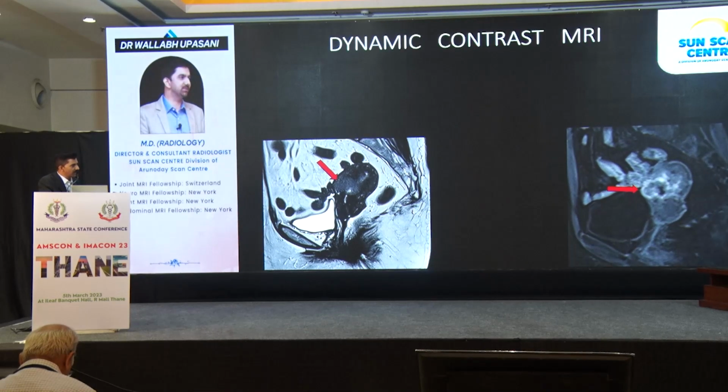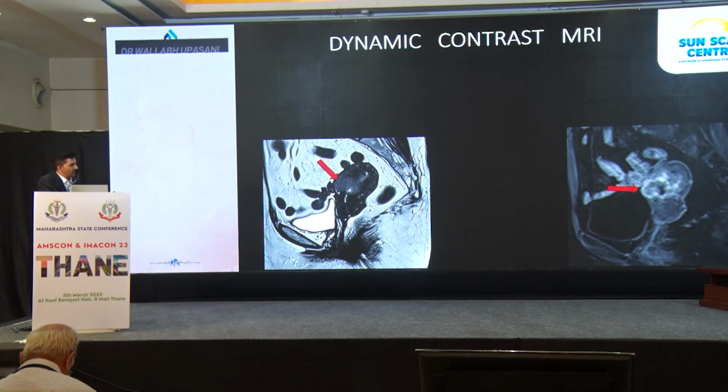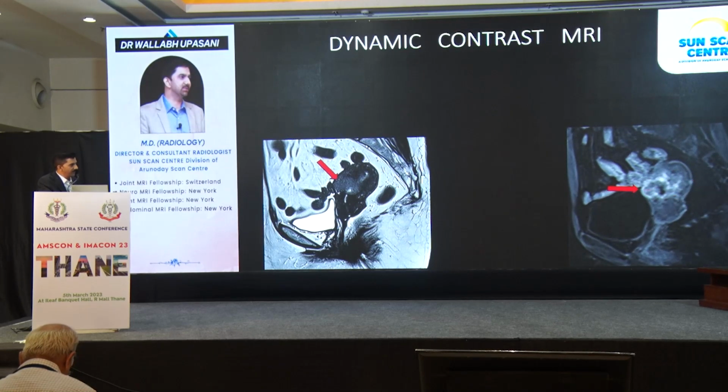Dynamic contrast can also help us in evaluating such pathologies where there is a CA endometrium with myometrial invasion, and dynamic contrast helps us to be more sure.